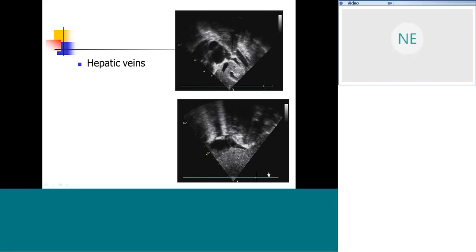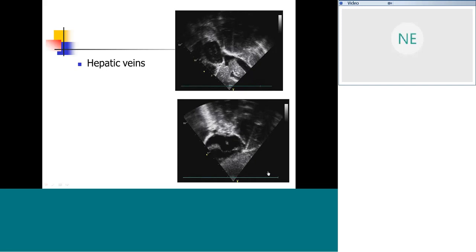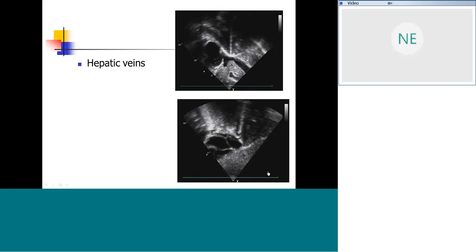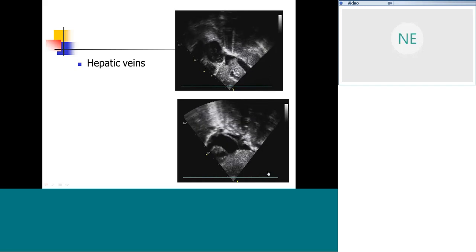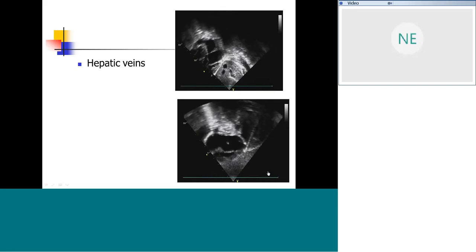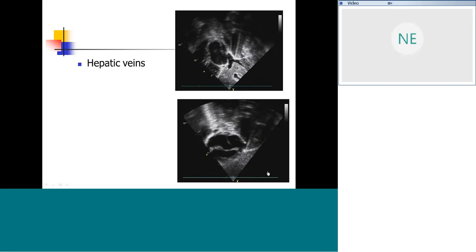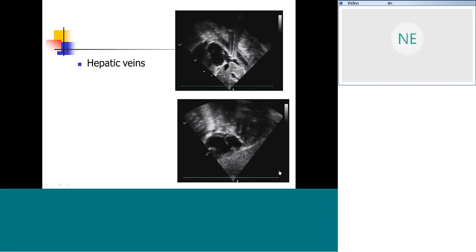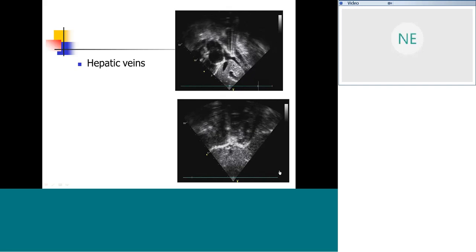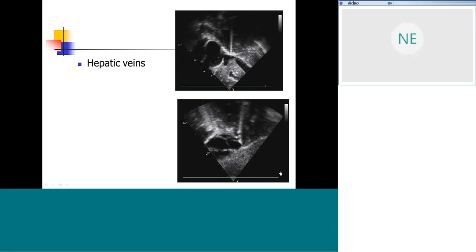The left-sided atrium, because this is a child with ambiguous situs. And hence it is very, very important that hepatic veins and IVC may drain anomalously, but the final determinant is going to be the fossa, limbus of fossa ovalis and the eustachian valve and the right atrial appendage. The right atrial appendage is actually based on the morphological characteristics, but there are ways on echo to determine where the right atrial appendage is.